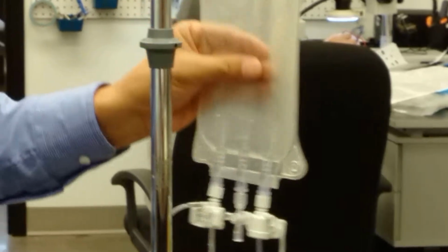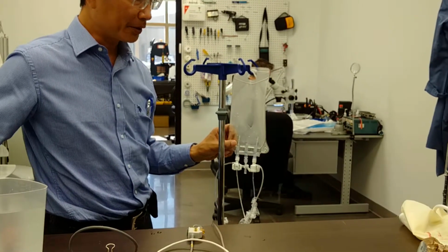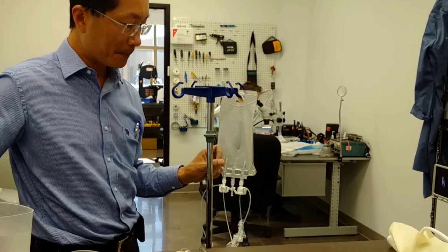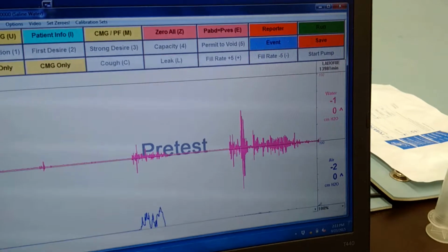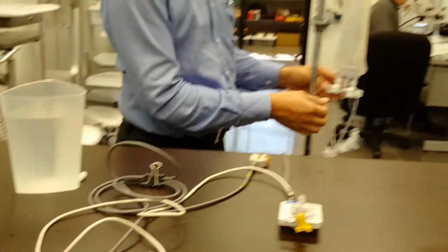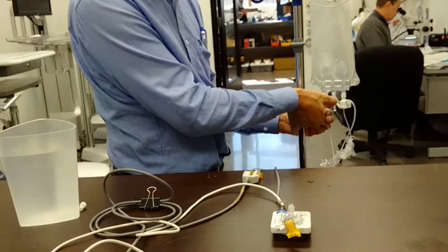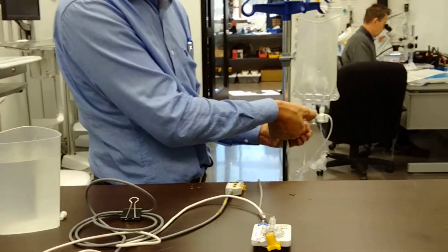It's mostly air space and not a lot of air in it, but we're trying to simulate the rectal situation, not being fluid filled like a bladder. And if we take a look at the setup right now, they're both the same at approximately 0. It's approximately the correct height. I'm going to move the air. I'm going to push it up, clearly further up into the rectum.